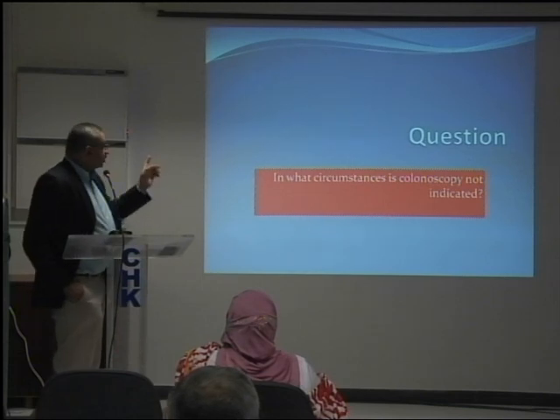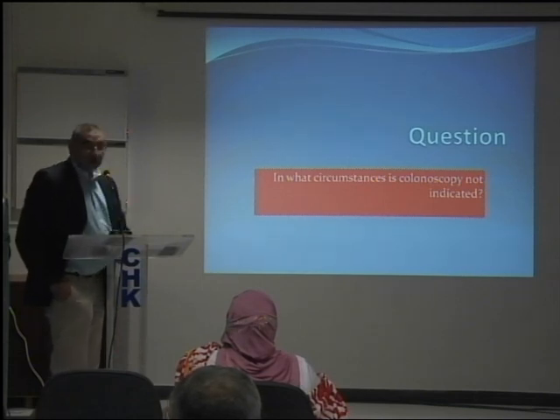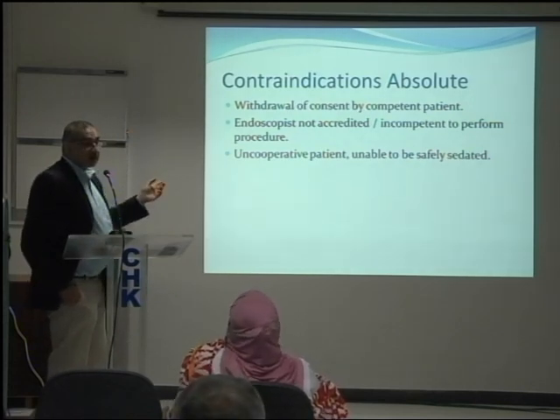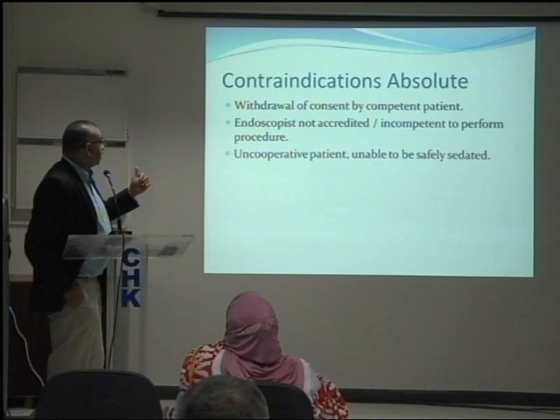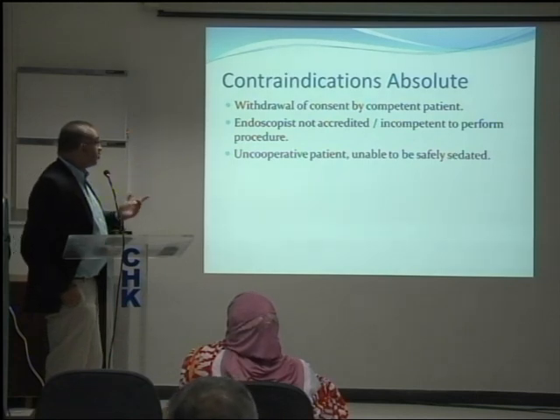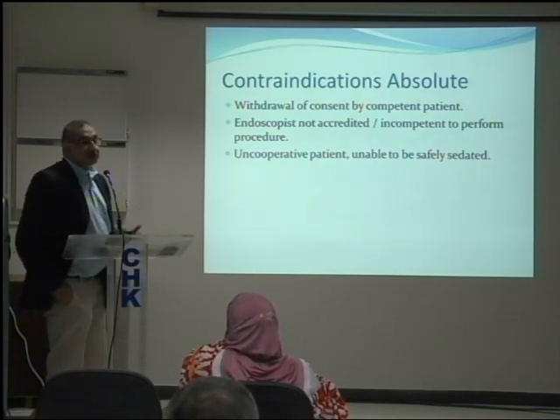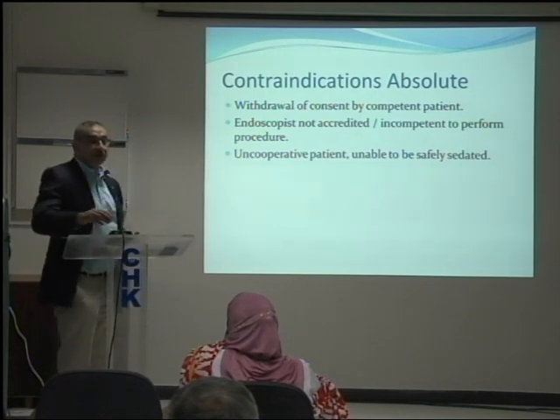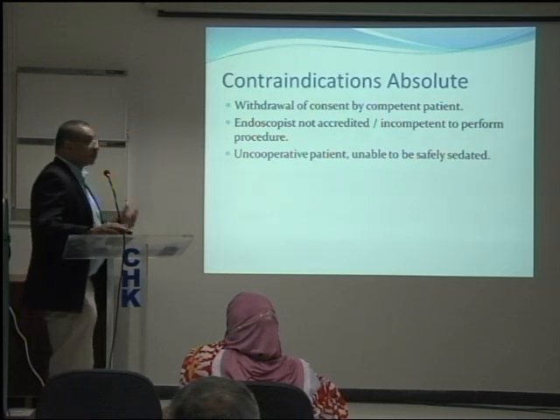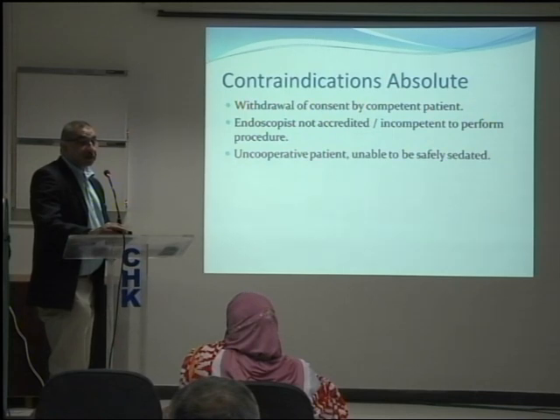Most important is in what circumstances is colonoscopy not indicated. It is not indicated if there is withdrawal of consent by the competent patient. Another case in which colonoscopy is not indicated is if the endoscopist is not accredited or is incompetent to perform the procedure. Not because somebody has bought you a new colonoscope and you start doing it. That is not ethical. It should not be practiced. Uncooperative patient who is unable to be sedated, if he's jumping off the bed, the procedure is painful, you should stop.